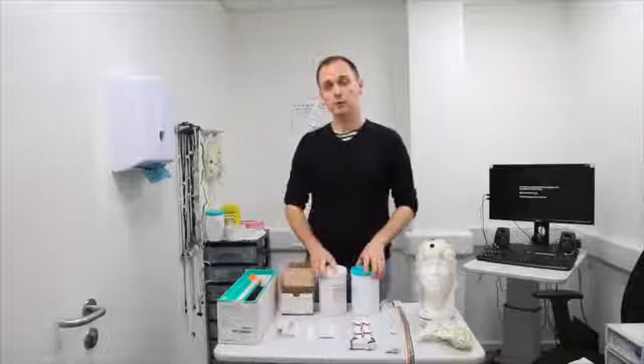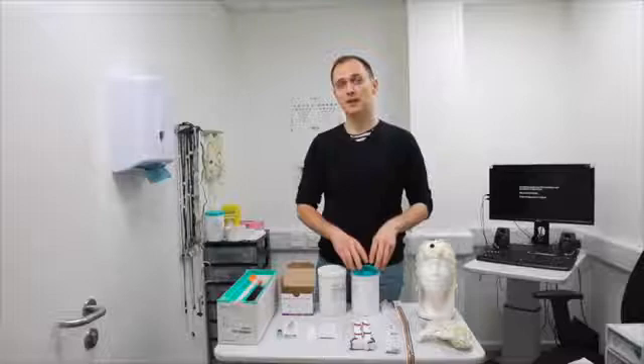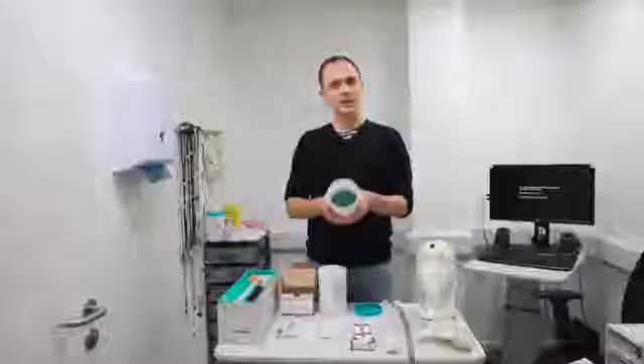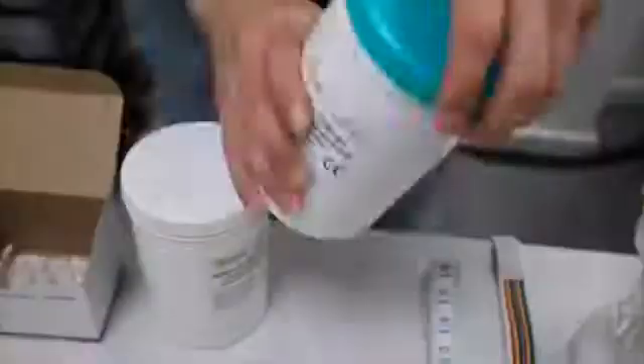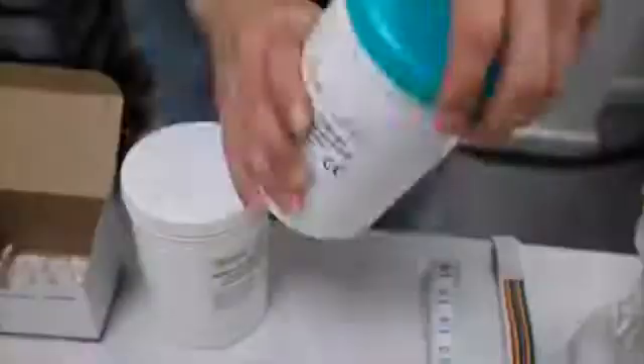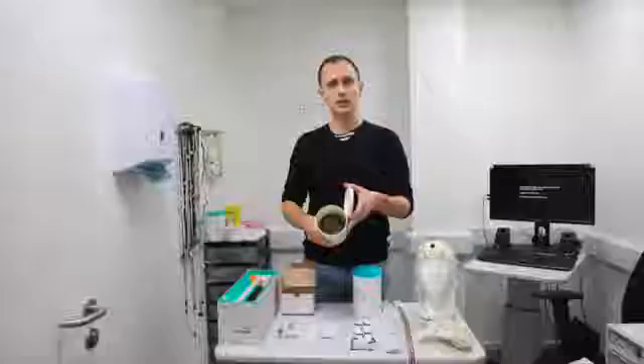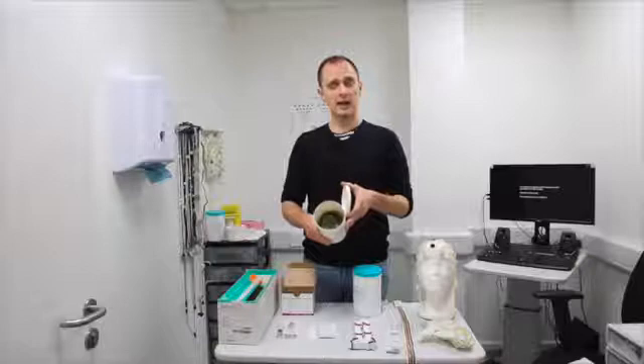There are two different types of gel, and it's important to make sure that you get the right one for your experiment. For the ActiCap electrode set, you need the gel with the green cap. When you open it, it looks like what I call alien blood — this green gel is the one you need for ActiCap experiments. Your lab may also have gel with a white or gray lid, which looks different inside. You should never use this type of gel with the ActiCap system.